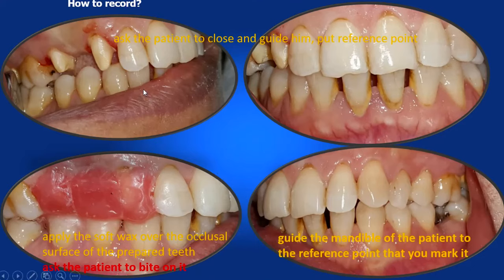As for the procedure, here we have a three-unit bridge, premolar to canine. After you prepare and take the impression, now we want to record the occlusal relation. When we record, the recording material should be placed over the area of the prepared teeth only, and the missing area.